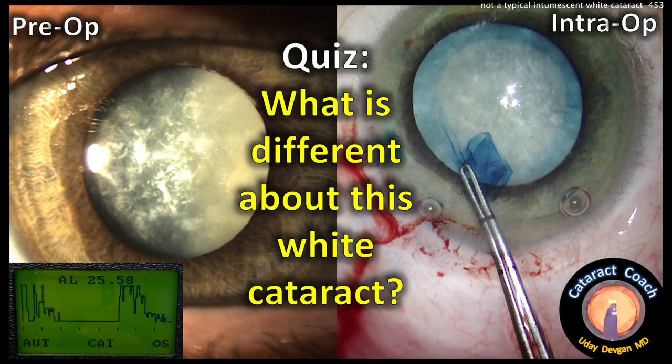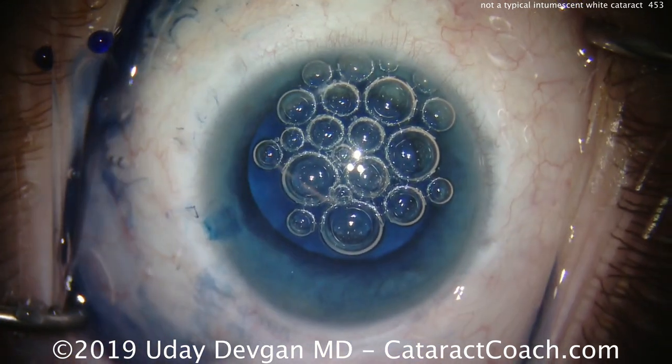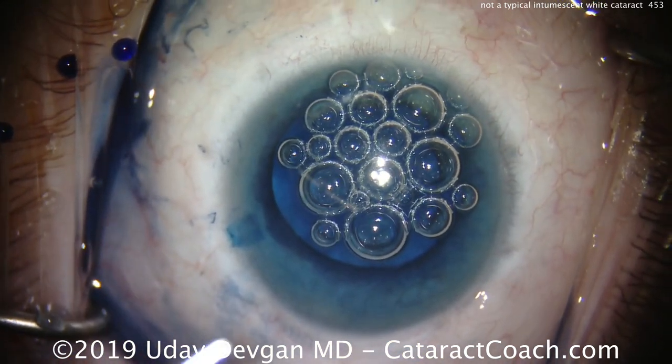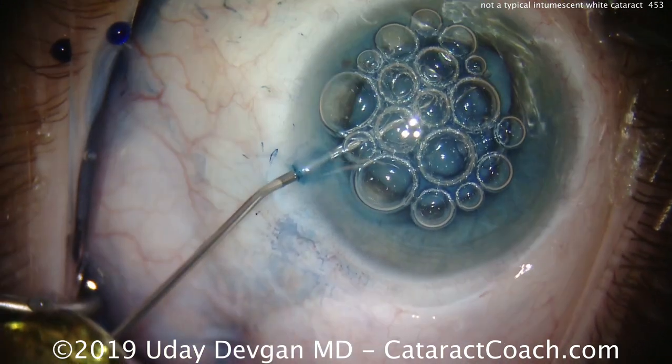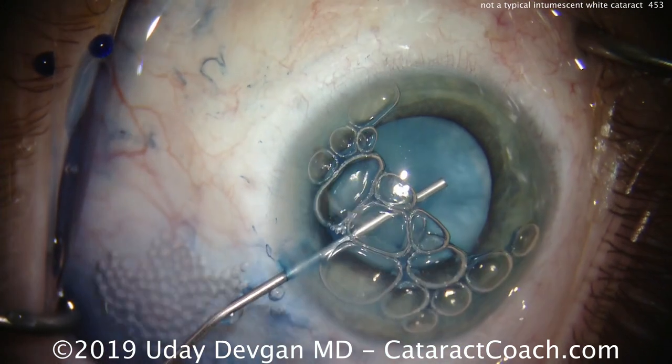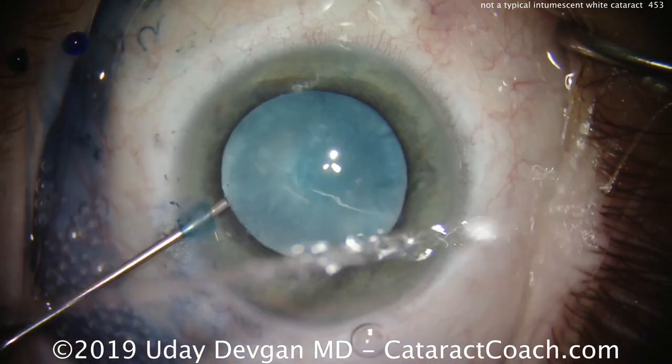CataractCoach.com quiz: what is different about this white cataract? Look carefully at the picture — the answer is there. We're starting off staining the anterior lens capsule with trypan blue dye, and now we'll put in our viscoelastic. This is a dispersive viscoelastic. Get the air bubbles out of the eye and get a nice fill of the anterior chamber.